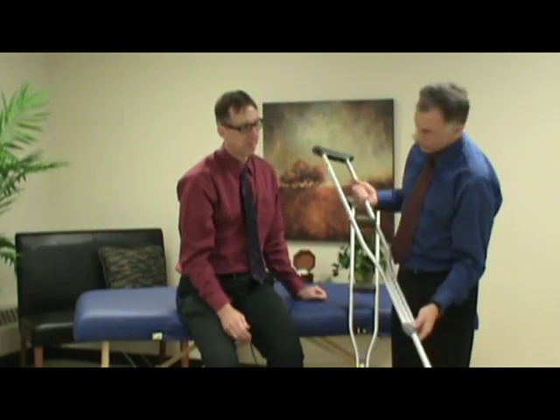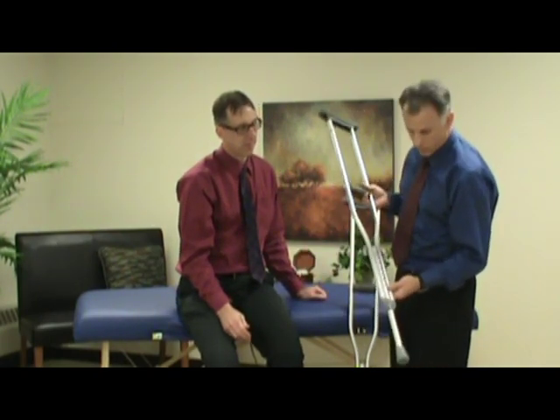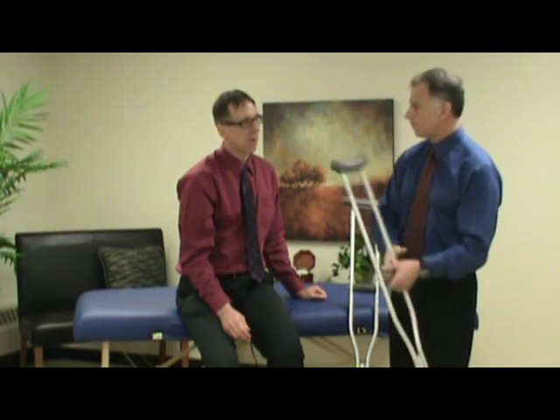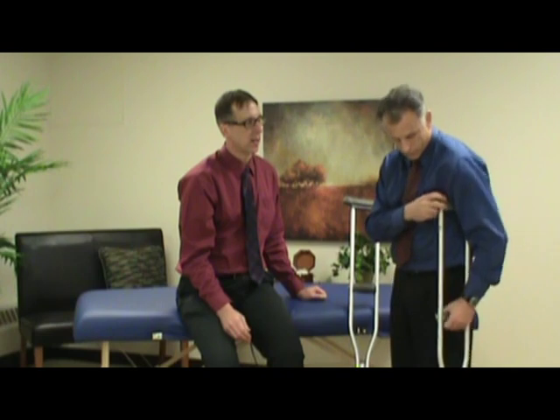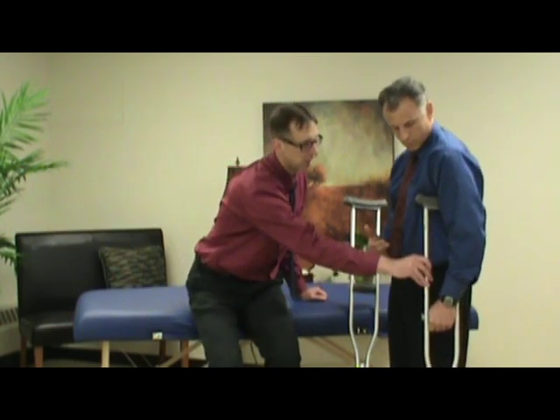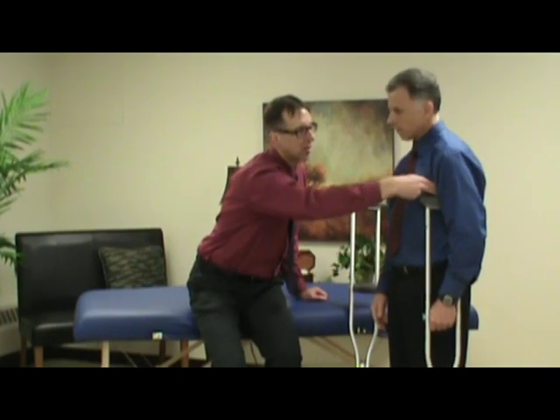Most all the crutches now are really easily adjustable, and they will have markings on here so that you can easily adjust. That's probably where you want to start if you know what your height is. So with the crutch kind of straight up and down, Brad, I still can get two fingers in there.